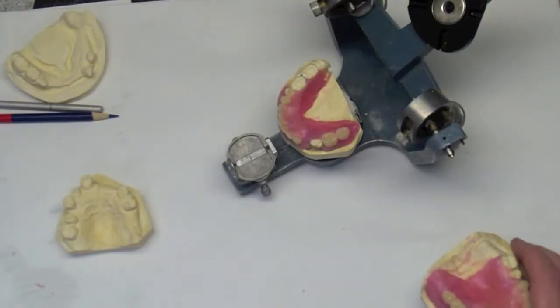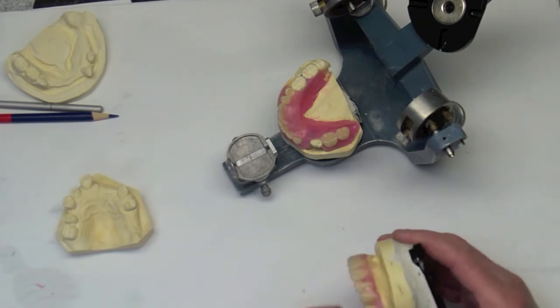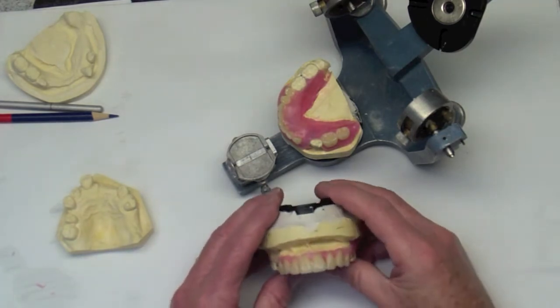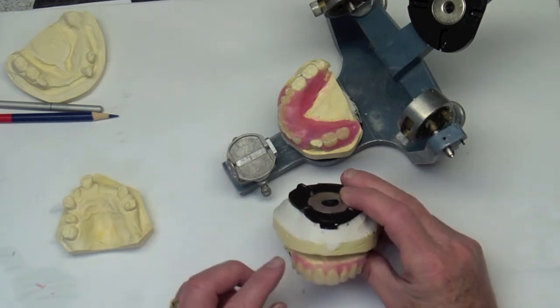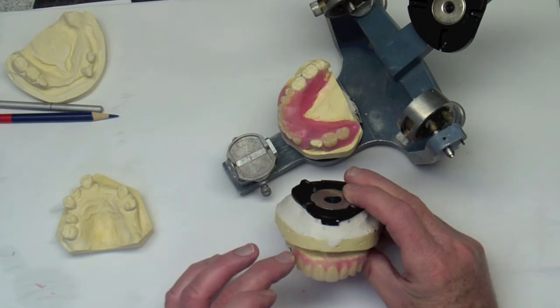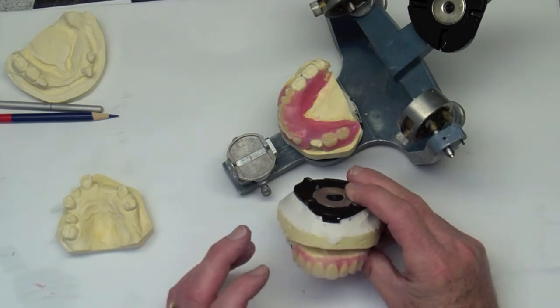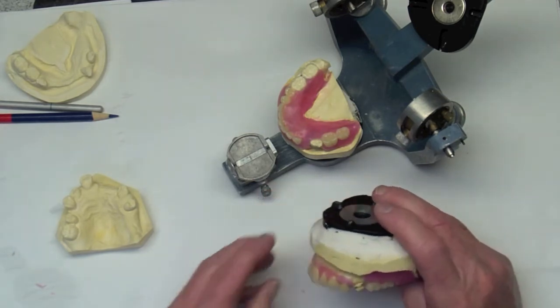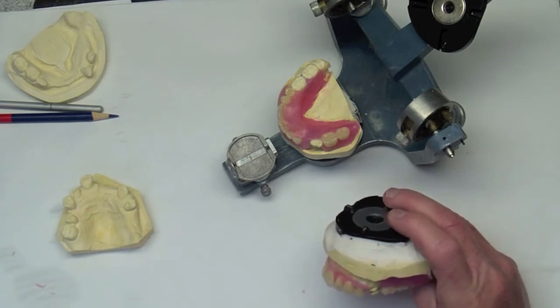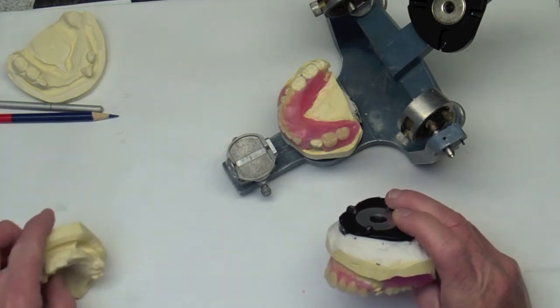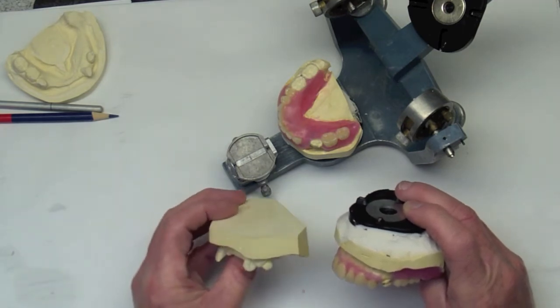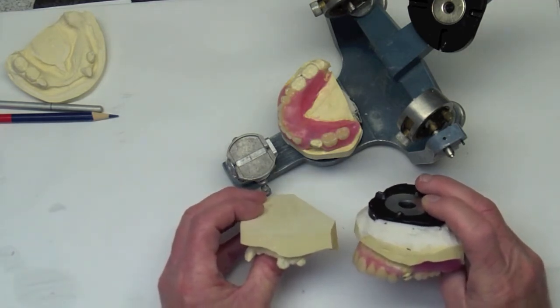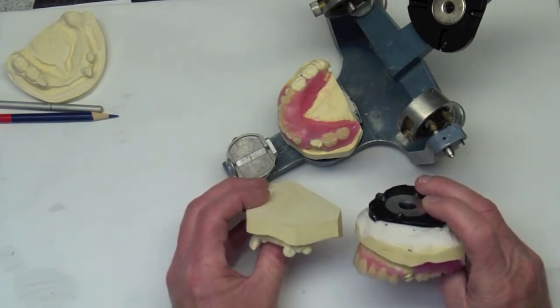So what I've done is we moved part of that anterior flange that we had waxed in before and, as you can see, I cut it back quite a bit. Because I really want to make it a so-called flange-less denture and just have it butt right up against the ridge. And even with that said, you can see in profile that we still have a significant amount of undercut there. And that the teeth, even though they're a little bit more positioned lingually, when you compare it to the forecast, you see that we've maybe improved the tooth position.